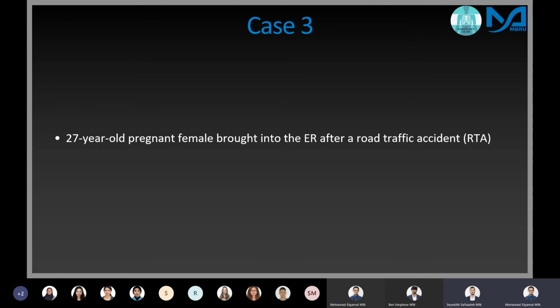Thank you for coming. Maybe we go with the CT after consulting different doctors. Yeah, that's a good point, Said Ali, and I'll definitely get back to that. I agree with you as well. We should definitely still do the CT because if you think about it, there's no baby if there's no mother. We have to make sure the mother's alive so she can keep the baby alive. But I was honestly hoping someone would say, oh, we could just do an ultrasound. And that is also a correct approach, especially by the guidelines.